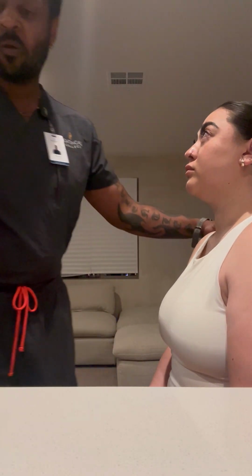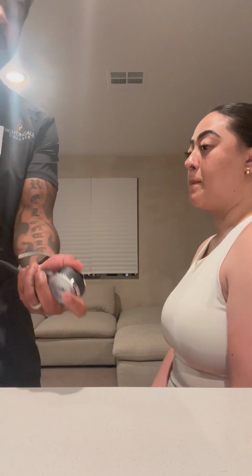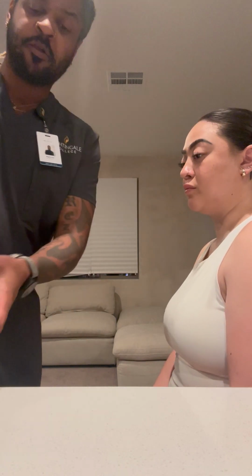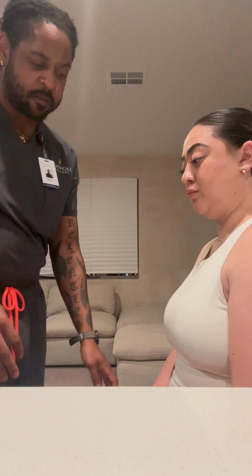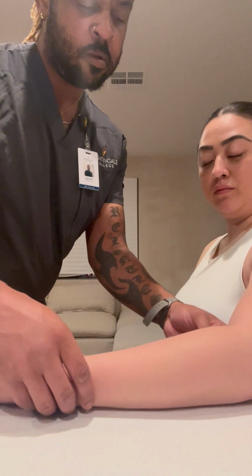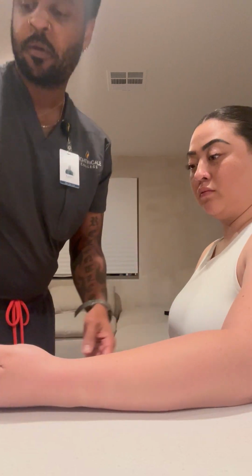Alrighty, Chelsea, so next what we're going to do is we're going to take your blood pressure, okay? Okay. Now, for the blood pressure, your feet are already on the ground, so that's good. Would you mind placing your arm on the countertop? Okay, is that comfortable for you?